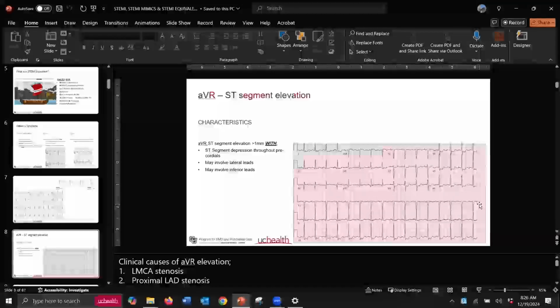And to change that thought process throughout medicine, right? Getting away from STEMI criteria, adding in the equivalent criteria, because we just listed what, 9 equivalents, and those are the things that we're missing. Would assessment pearls help you with that? And I don't know.